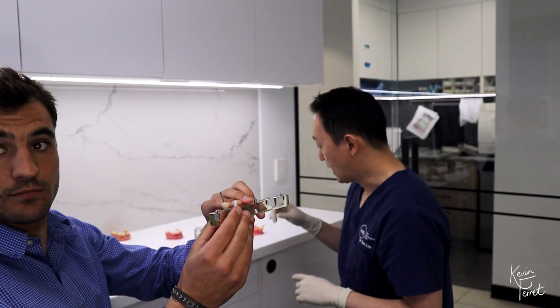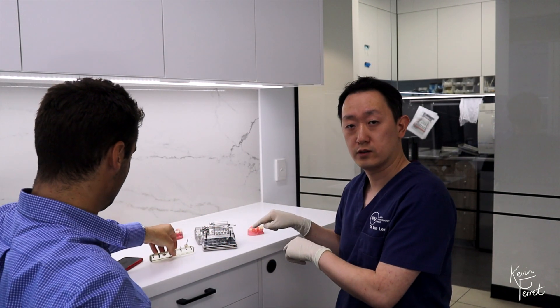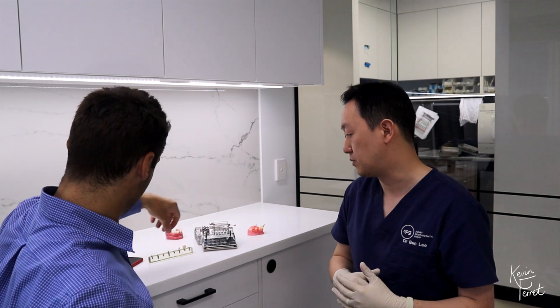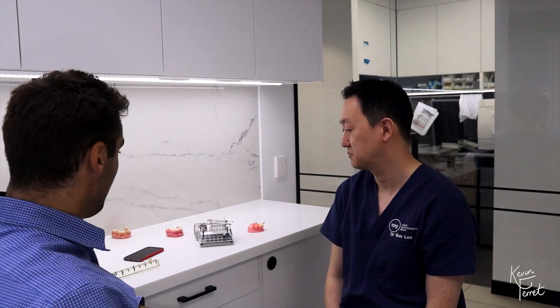It's very important to know that you cannot use the Unigrip driver to engage these ASC abutment screws. They will definitely not engage and will end up stripping the head of the screws.